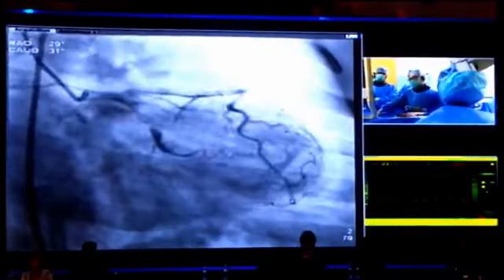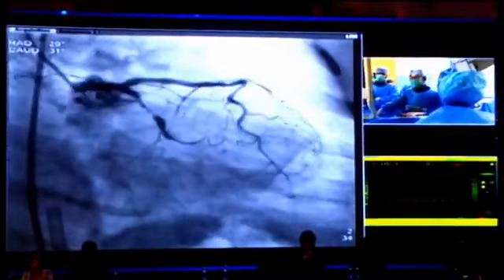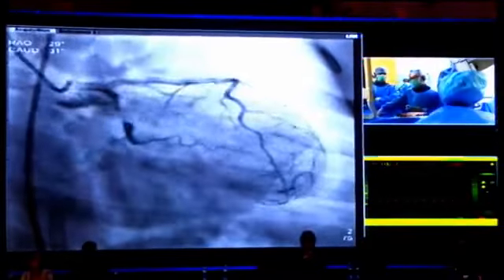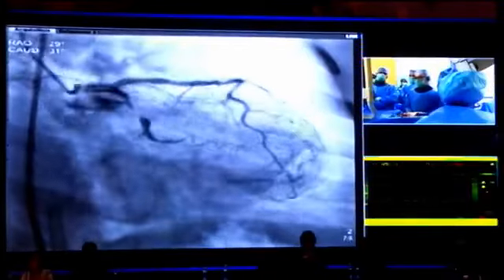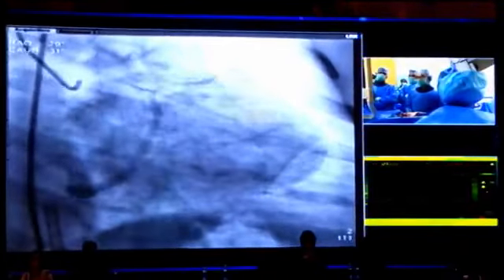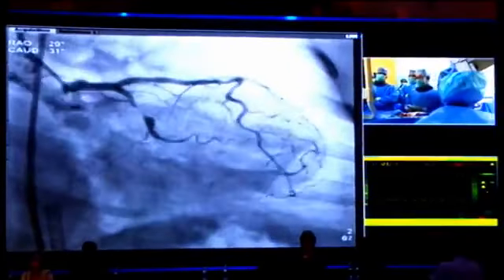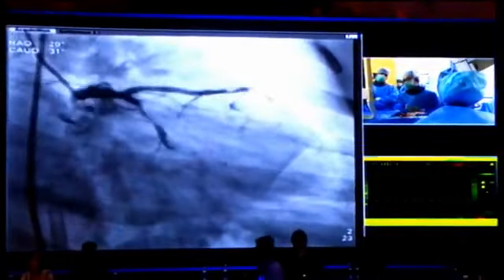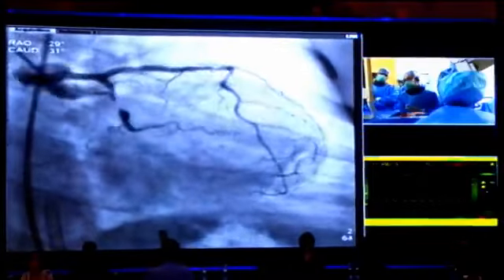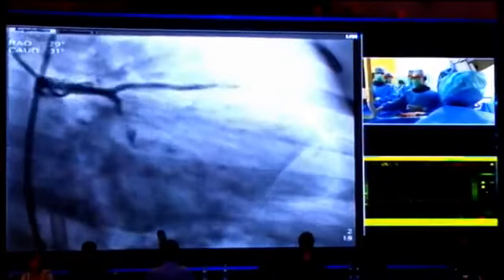The entry looks abrupt, so we cannot see it, and I will show it later from another angle. Another problem is the severe stenosis, almost 99%, proximal to the CTO entry, so maybe we have to fix this lesion before the CTO PCI procedure. At this time we can see the AC branch, but it is not connected to the CTO distal part. Usually we can see a zigzag collateral, but in this case we cannot.